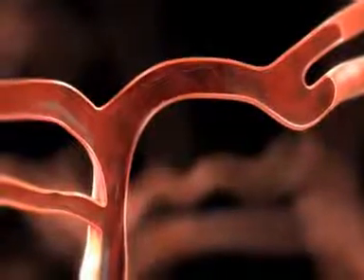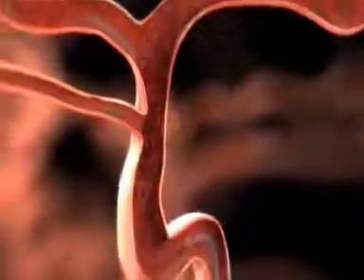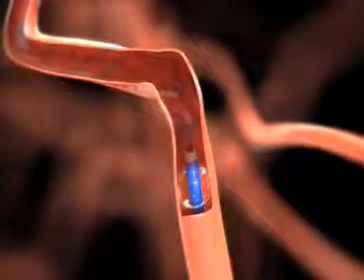To retrieve thrombus, slowly withdraw the microcatheter and Solitaire FR as a unit to the guide catheter tip while applying aspiration to the guide catheter.